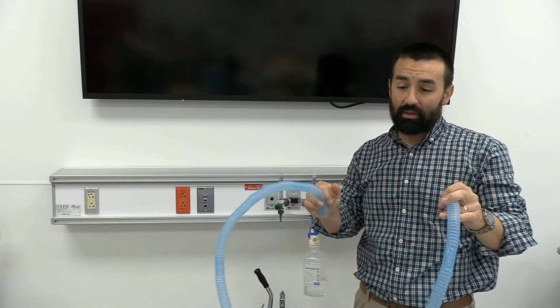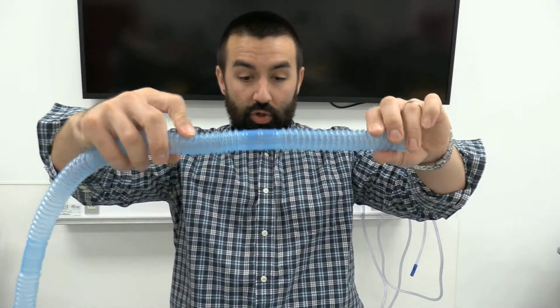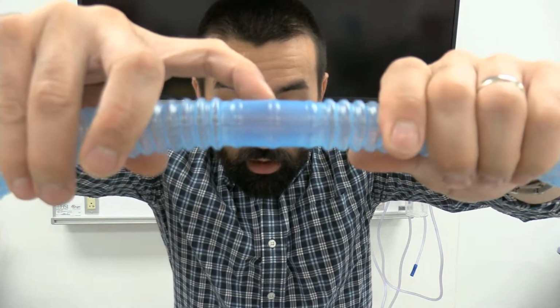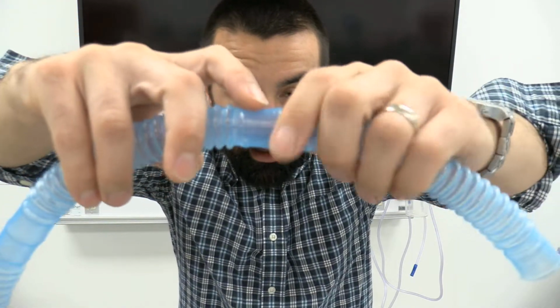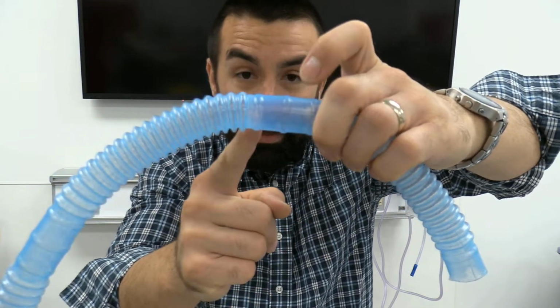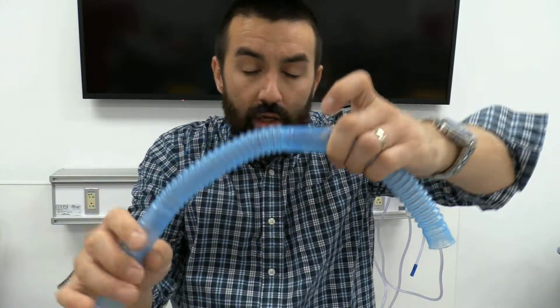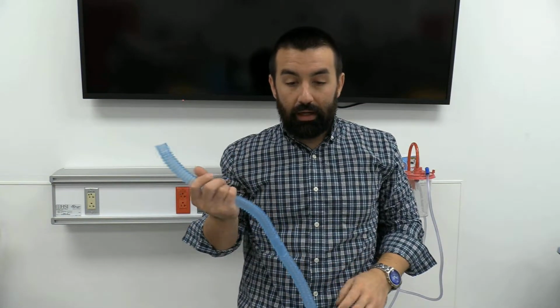And we're still gonna have to trim some stuff up when we get back to the patient's room and kind of look at everything. It is important to note that if you have to trim this stuff, if you look, there's a little line right here in the center. You want to make sure you take your shears and cut right along that line. If you cut it off to the side here or there or back here, you're never going to be able to easily get that on these 22 millimeter connections, okay? You're making life way harder than it needs to be.